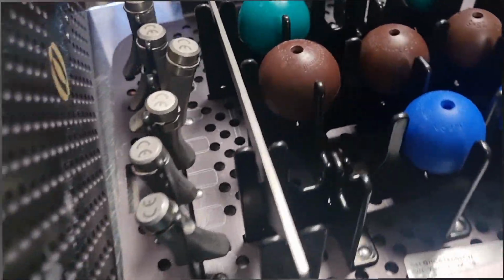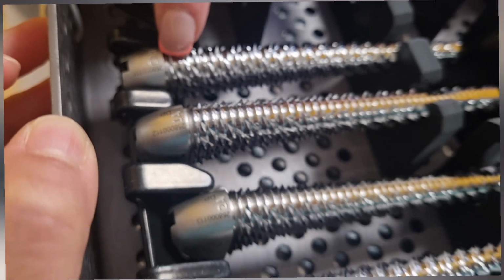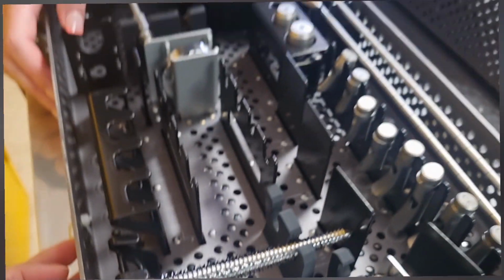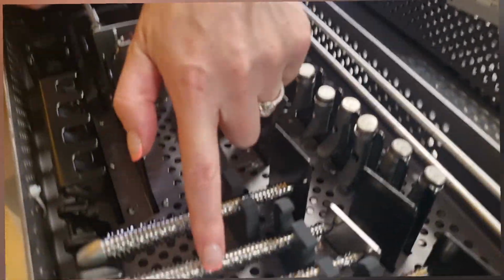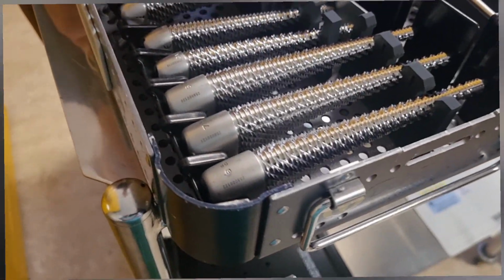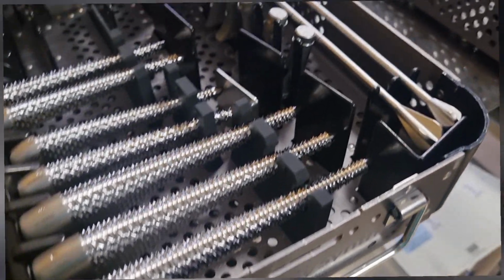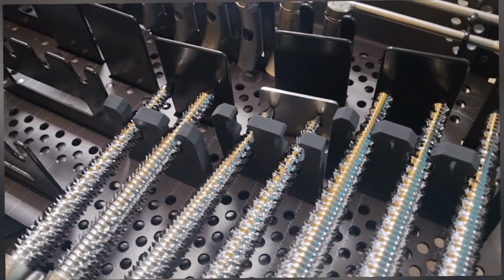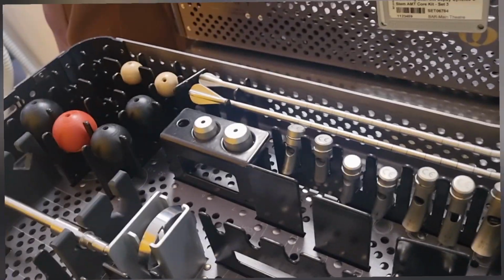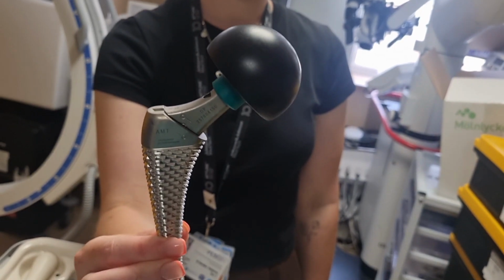I remember the extended tray has the smaller ones. What is this? CDH, which is dysplastic. And then 1A, 2A, 3A, and then the really big ones, 6, 7, 8. So 1 to 5 is your standard. So this is the trial, and the actual implant is opened fresh from a sterile packet.